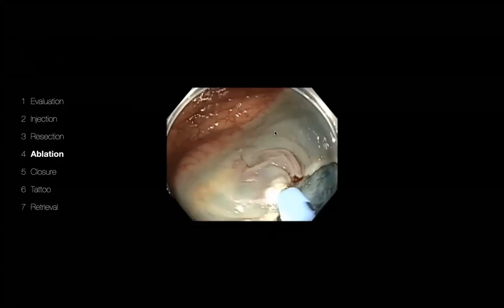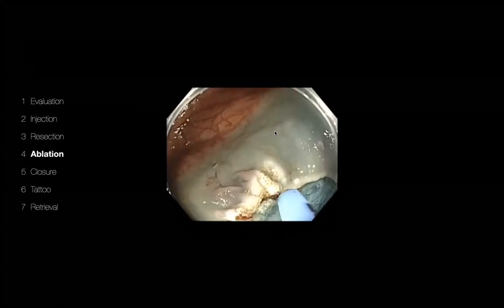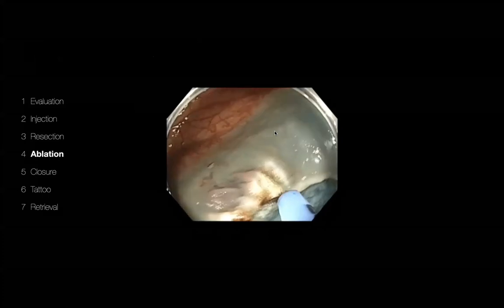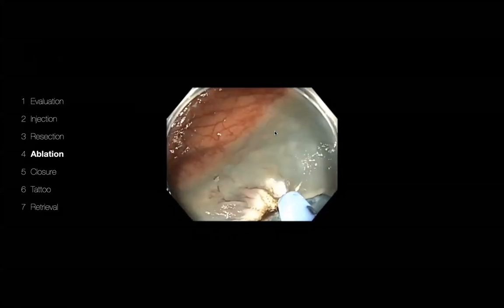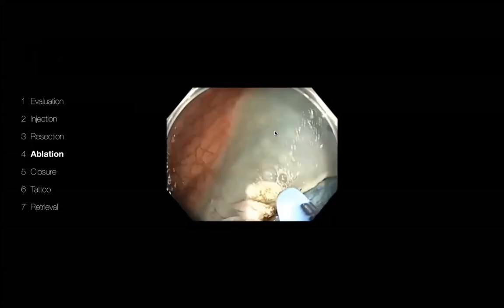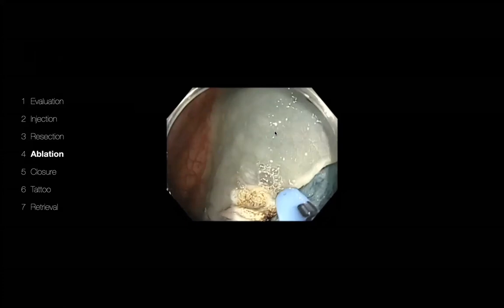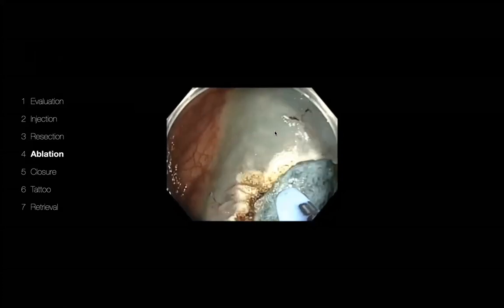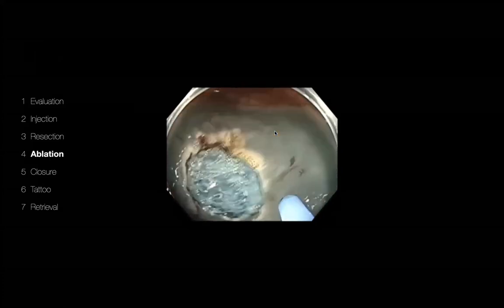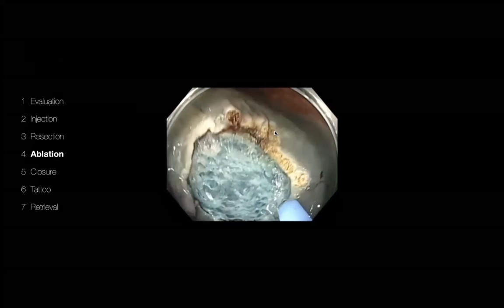All right. So what I would like to do is share with you, when I started at Anderson in 2009, I said to myself, for every large polyp resection, I would do APC of the edge as part of the routine and see what happens to the recurrence rate. This is part of a protocol that I followed.